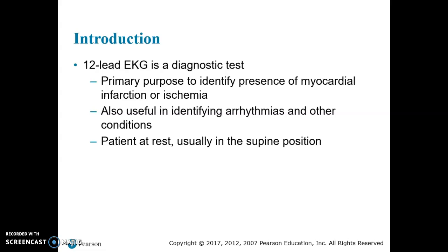With the EKG, we're going to put the patient in what is known as supine position, S-U-P-I-N-E. Just understanding some medical terminology. Supine means laying flat on your back. So we're going to put that patient in supine position, laying flat on their back, for this EKG.